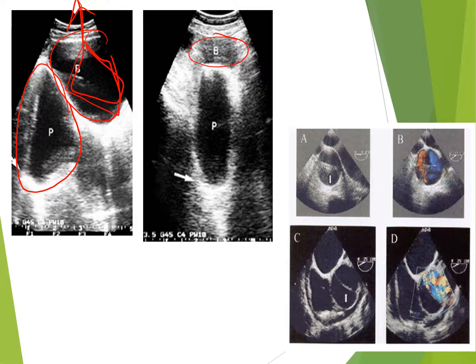Here we have it again in trans. We have our bladder. Sound is coming in and probably bouncing around through there before it's heading back to the transducer. Again, the machine thinks there's this long cystic structure deep to where the actual structure is. This has to do with calculating that go return time incorrectly and displacing kind of this odd cystic structure. We also see it happen a lot with TEEs and the aorta. So we have the atria here, and then we have a strong reflector, and we have the aorta sitting behind it.